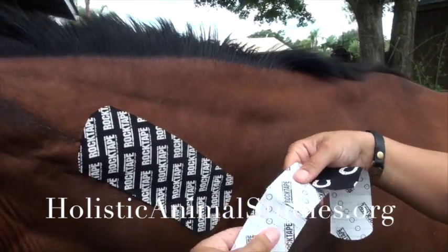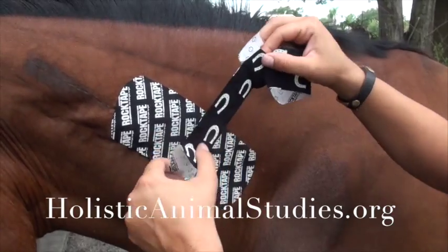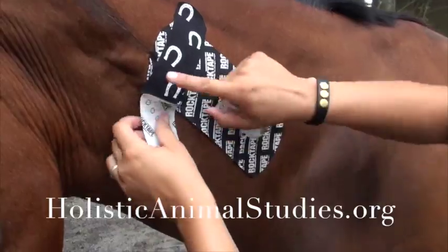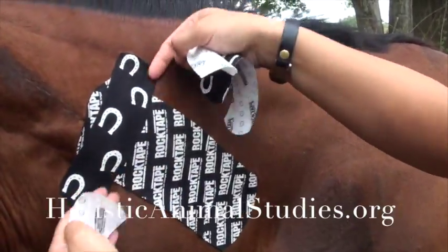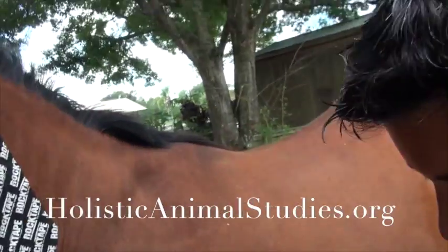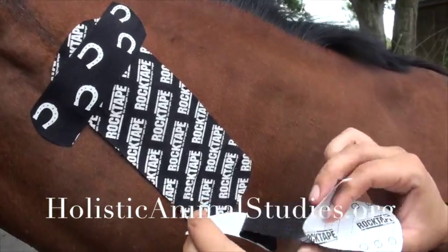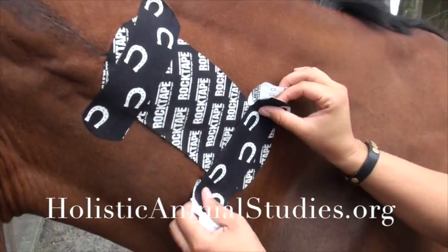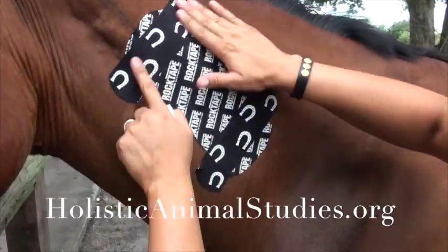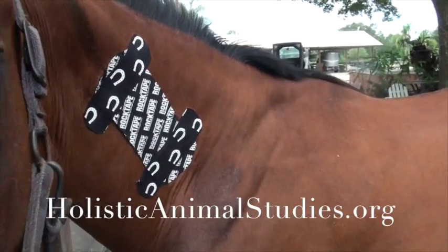I'm going to tear this tape in the middle to make it a bit easier and peel those edges up. I'll place that down right there, putting just a little bit of stretch into it — not very much — and absolutely no stretch on the ends, because we don't want those ends to pop up. And I'm going to do the same thing down here: tear the paper in the middle, give it a little tiny bit of stretch, place that down, and rub it down real good. And that is a pain taping.